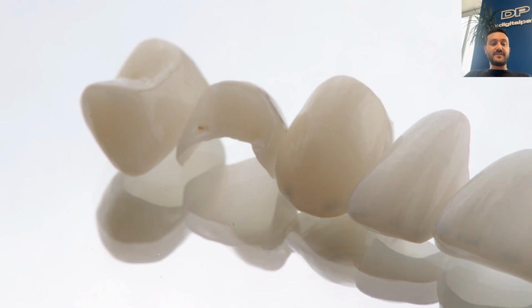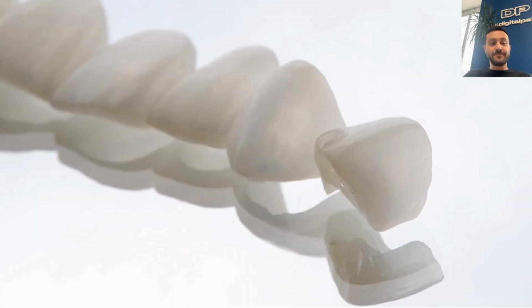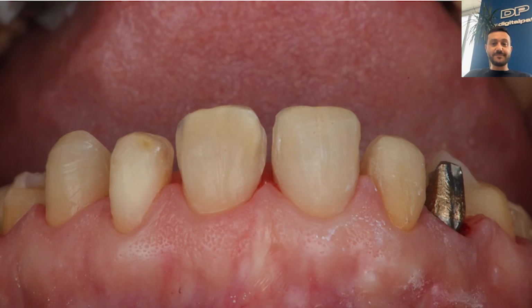Here we can see the veneers in a clear, natural setting. Each veneer is slightly different, just like the real teeth, to match the individuality of the patient. The thickness is minimal, the edges are delicate, and the color is layered to reflect light naturally. This is the kind of result you get when planning is precise and execution respects both the material and the anatomy. Here we can see how each preparation is slightly different, carefully adapted to the specific tooth and its condition.